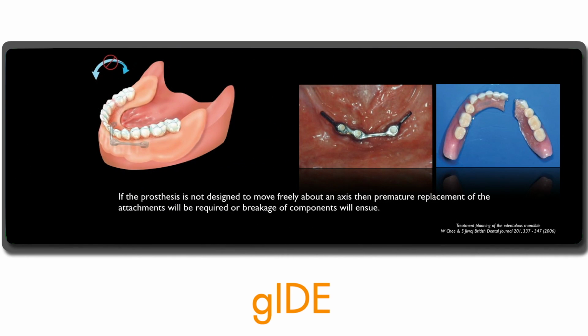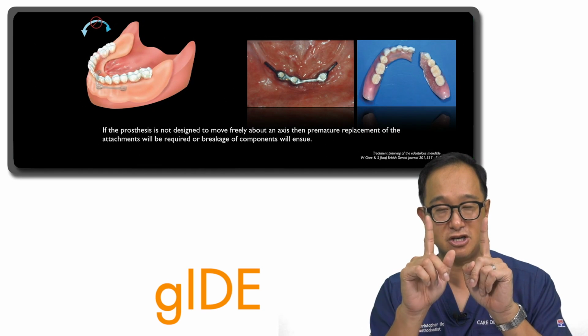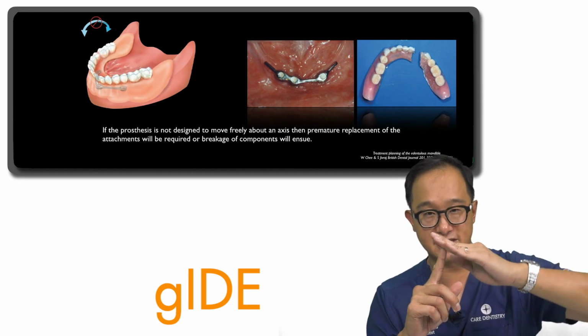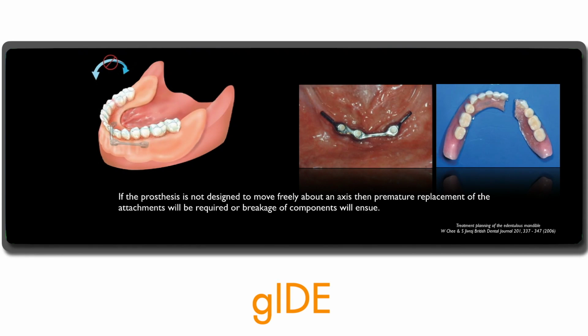If you're going to use a bar type prosthesis, this may not be so suitable for these sorts of cases because as the patient functions, there's more rocking around the prosthesis, and as it rotates around that point of rotation, you might get a point of weakness where it fractures because the acrylic is thin in that region. So I would recommend to either use locator attachments, or if you're only using 2 implants, it'd be only really between those anterior implants that you'd have the bar. So there would be some ability for the prosthesis to rotate. Don't have these extensions like this image where they've extended distally and tried to make a removable prosthesis. It's just a recipe for disaster in that you'll get some fracturing occurring.